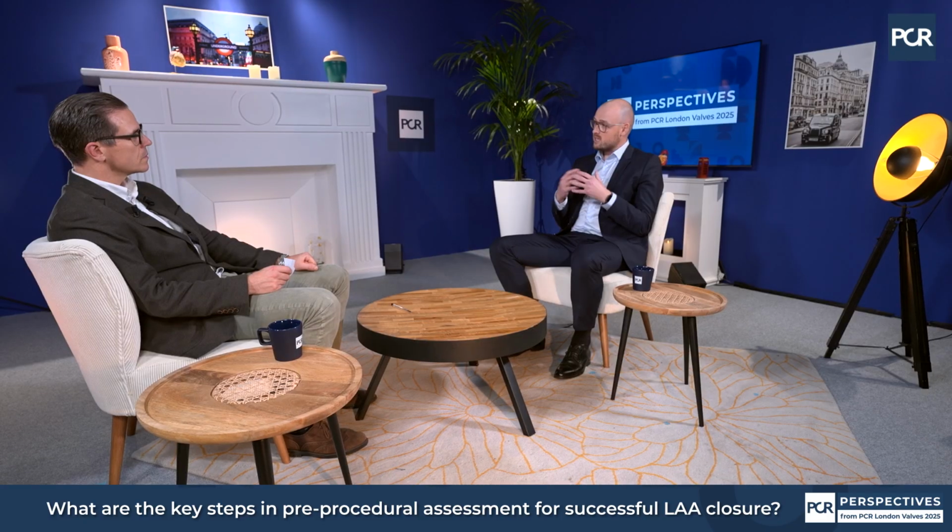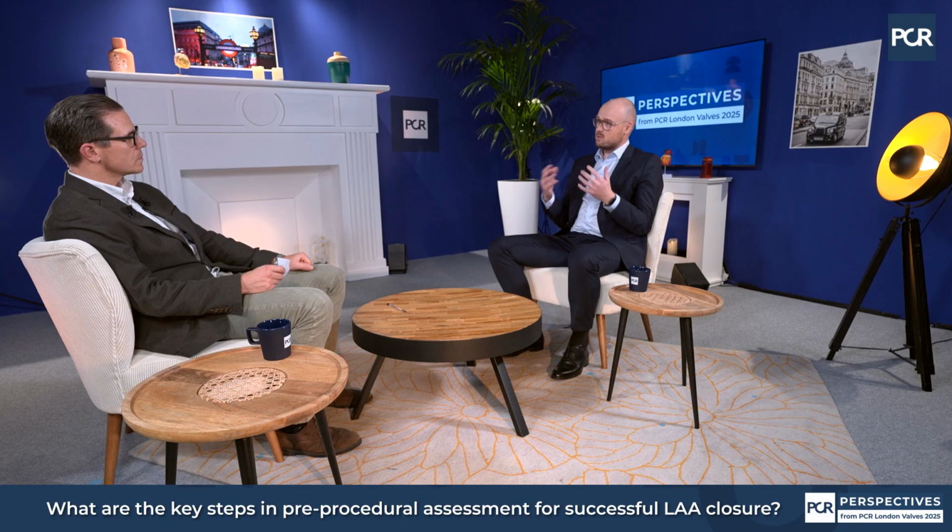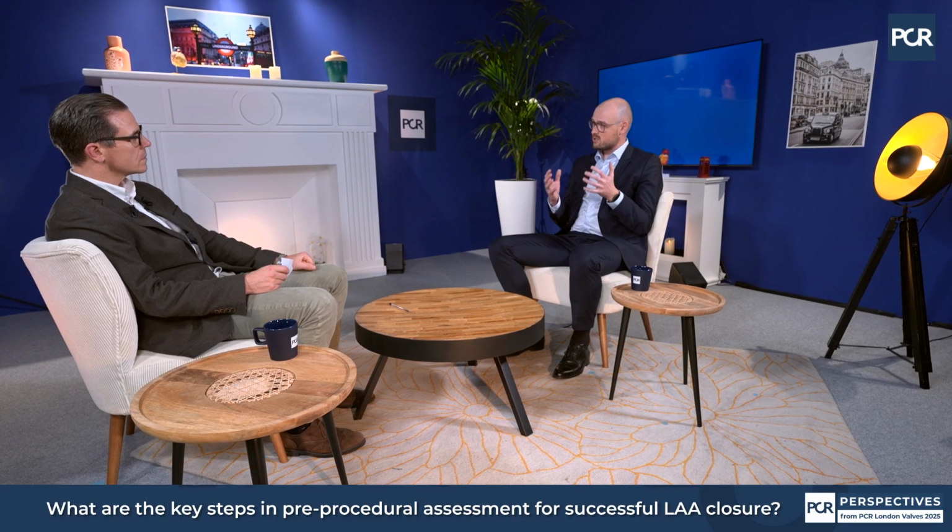Thank you very much for the question, Lorenz, and it's an important question. First of all, I think we need to exclude LAA thrombus before going into the appendage. And then secondarily, the left atrial appendage is a very complex structure. It's very heterogeneous, so as opposed to other interventions, this structure actually differs for every patient we treat. So we need to do imaging to plan the intervention carefully to mitigate the risk of the procedure and overcome procedural complications, but also to obtain optimal procedural results.